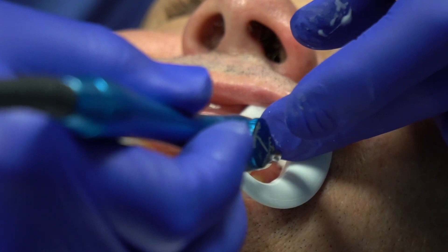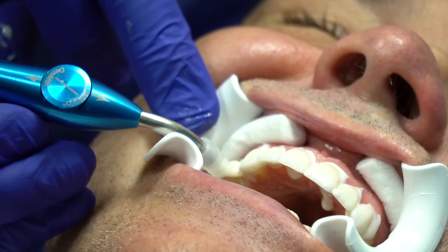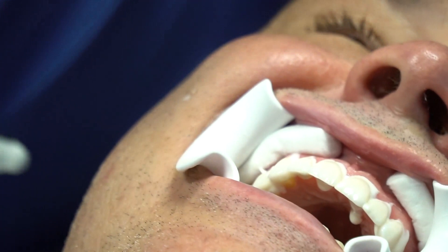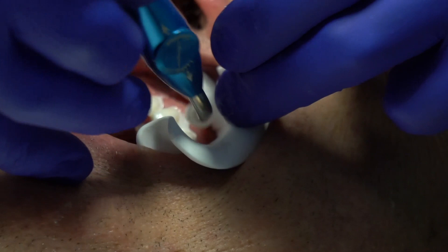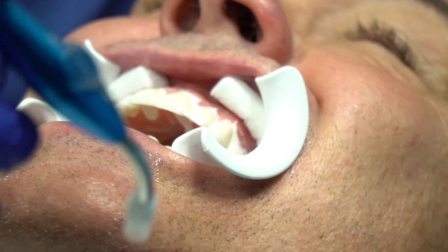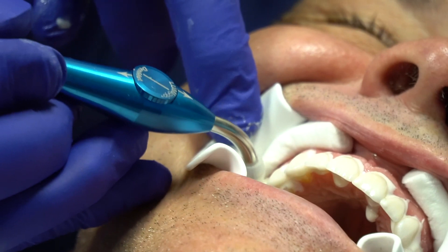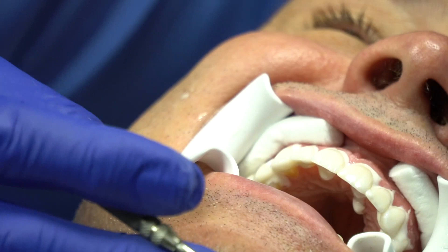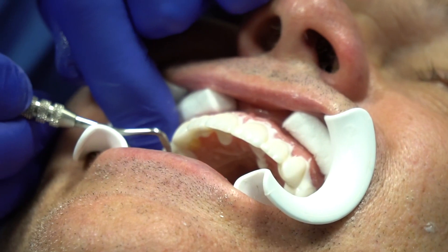Now we're on tooth five, just making sure it's all seated. A little piece of cotton there. The Lumi Grip lets me get in there and place them without any issues. Going ahead and looking, making sure we got all the resin in. I don't want to move these too much — seat, seat, seat, making sure they're all seated.